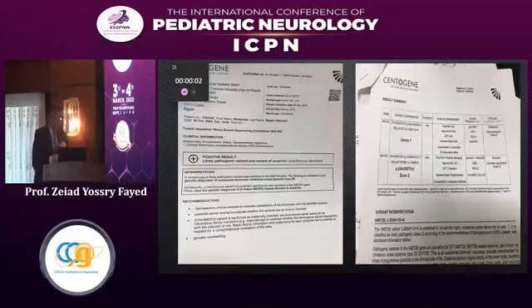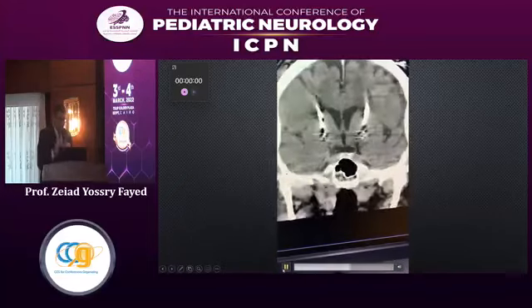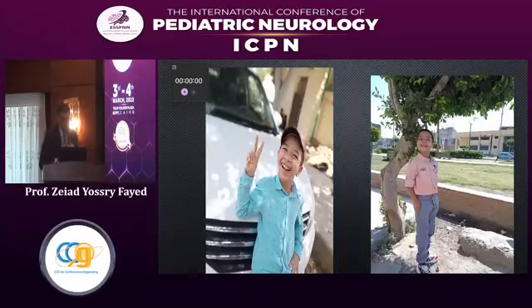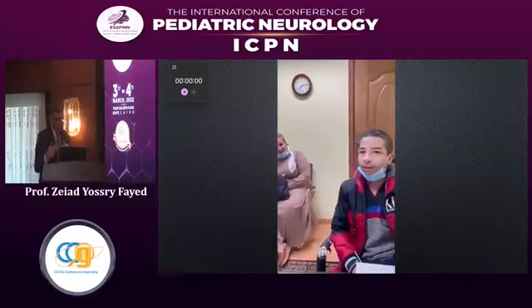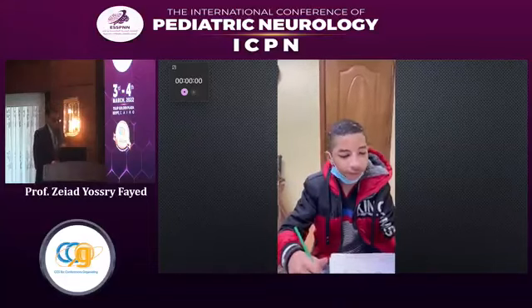He tested positive for the DYT28 gene. This is the deep brain stimulation device from the entry point going exactly into the GPI, or the globus pallidus internus. And after surgery, the patient showed improvement. He could walk. I couldn't find many post-operative videos, but those two pictures show that he can use his hand properly. And this is 1 month ago, the surgery was done over 2 years ago. The patient could use his hand. He was performing very, very well in school.